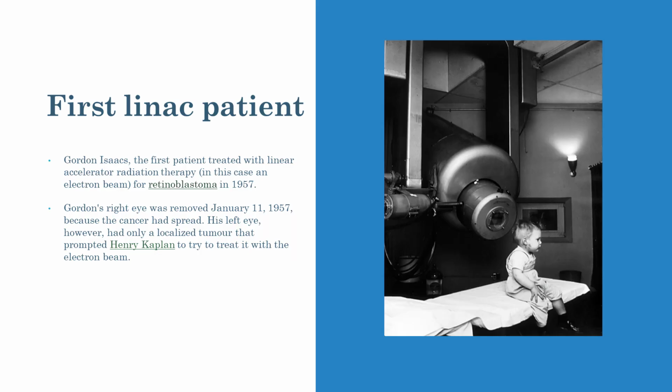Here we have a great photo of the first Linac patient. Look at the size of that machine. And actually, you'll recognise the fact it hasn't really changed all that much. You can still clearly see a collimator and it's on some form of gantry.